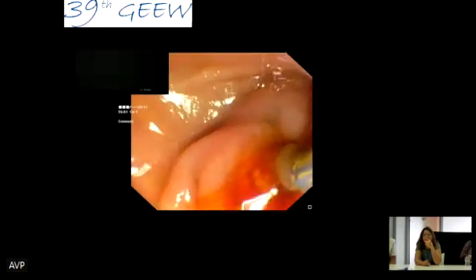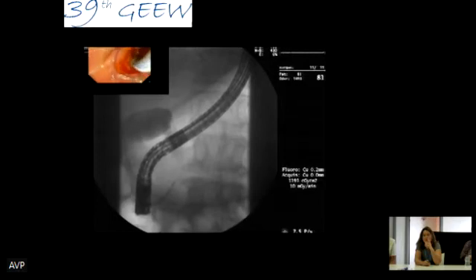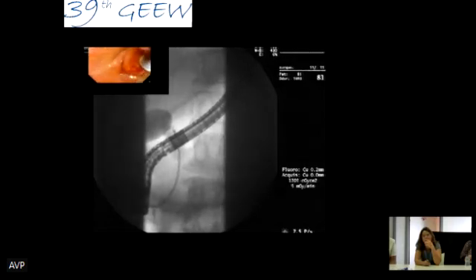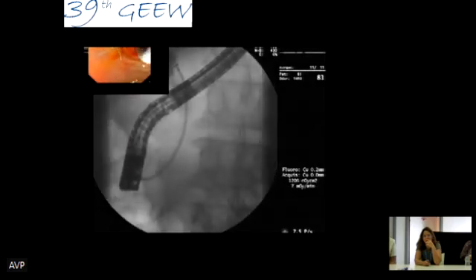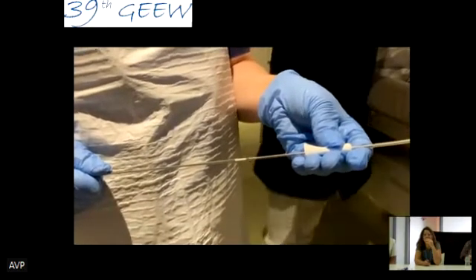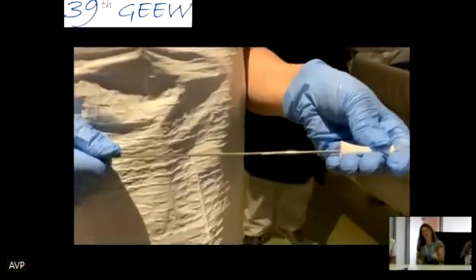We can see the stent. It's a metal mesh. It's on the yellow introducer. We also have fluoro to help us define that on the X-ray. That's the distal part of the stent. And here the right hand is blocked and the left hand is bringing back.